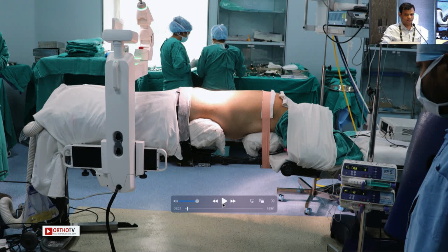So rightly said, these are two types of robots. One is the table-mounted robot, that's the Mazor X from Medtronic. And we have the ExcelsiusGPS from Globus, which is a floor-mounted one. XLS is totally dependent on navigation, and Mazor has its own artificial intelligence. The navigation is just an add-on where it gives you visual feedback. Otherwise, it has its own artificial intelligence.